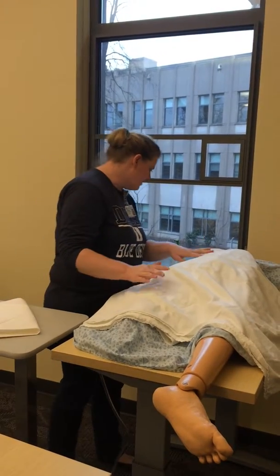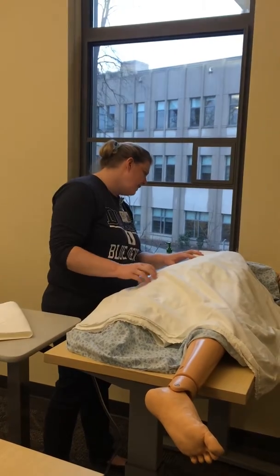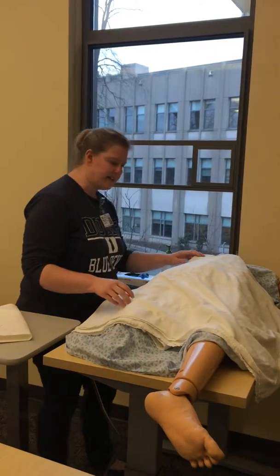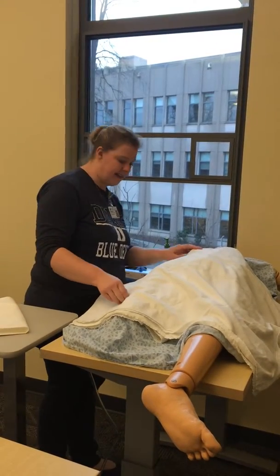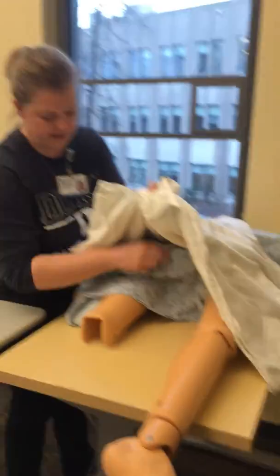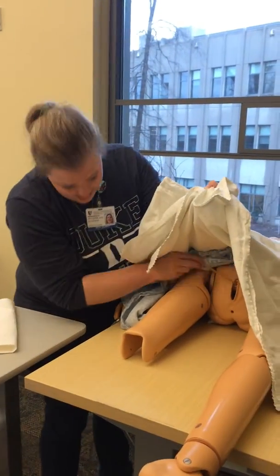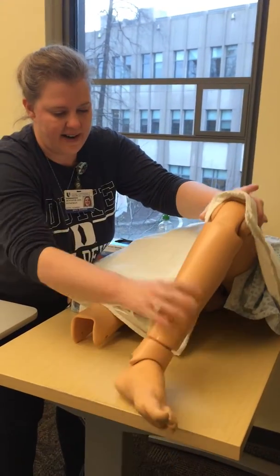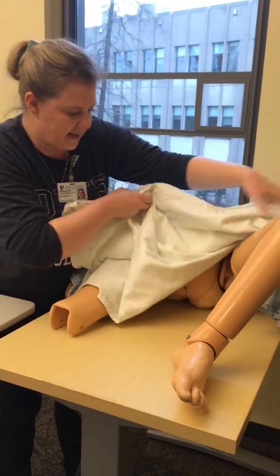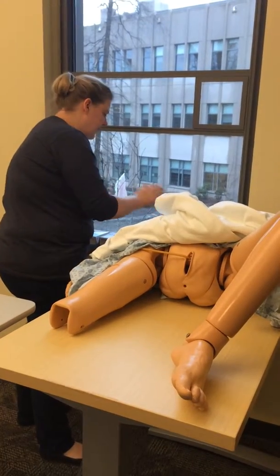We've already got this drape on you and we're going to pull the screen so that you have privacy. And just like earlier, I'm going to position your legs so that we can take out your Foley. I'm going to pull up here just a little underneath. Just going to position your legs here. I'm going to get some gloves on and perform hand hygiene.